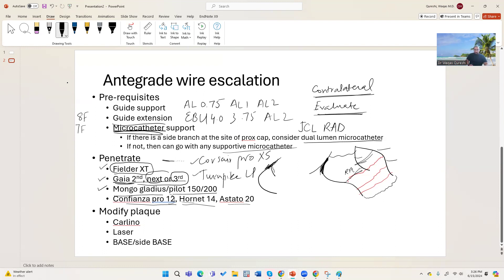My go-to approach has now moved toward Carlino. Carlino means you place the microcatheter right at the tip of the proximal cap and inject 0.5 to 1 mL of dye at slow speed, then flush with saline. This helps soften the proximal cap, and then you can try the wires again.